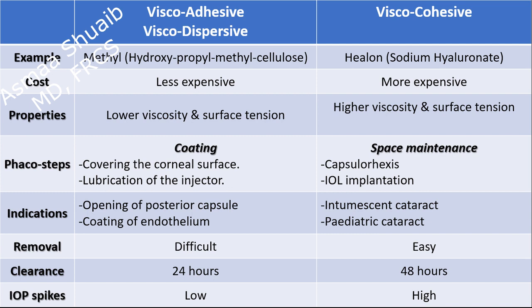So, there are lots of differences between the viscodispersive and the viscocohesive materials. And when you understand these differences, you can choose which one to use in different cases.